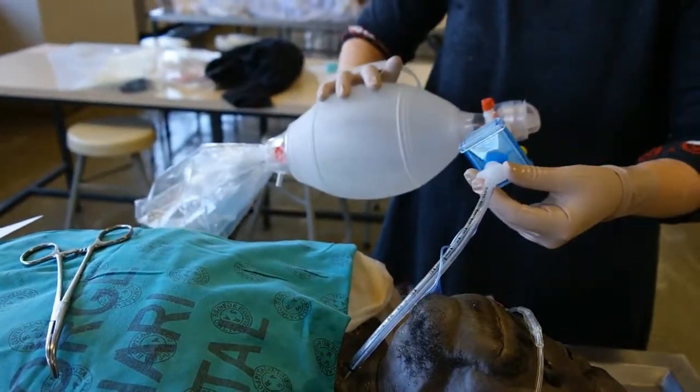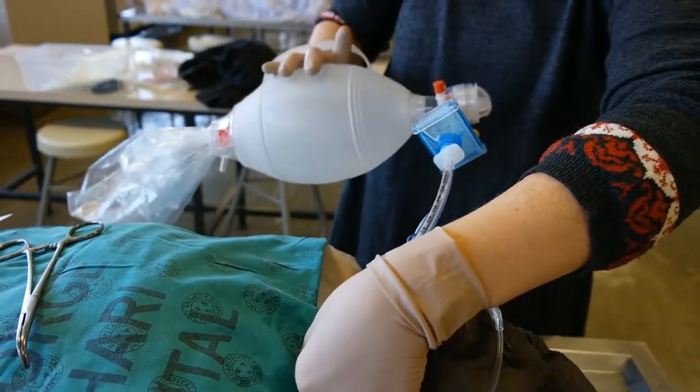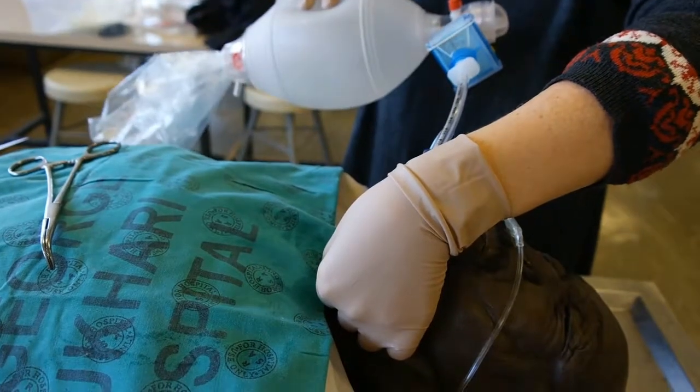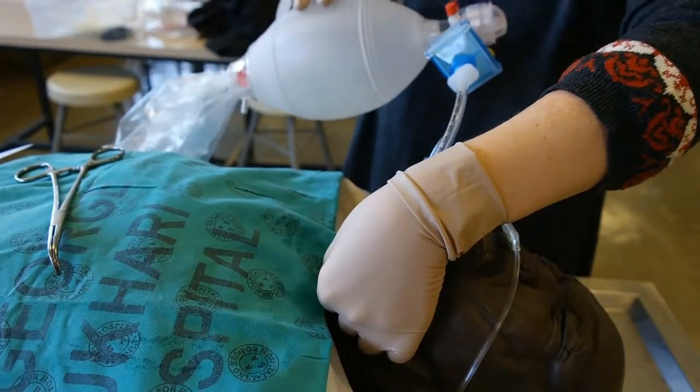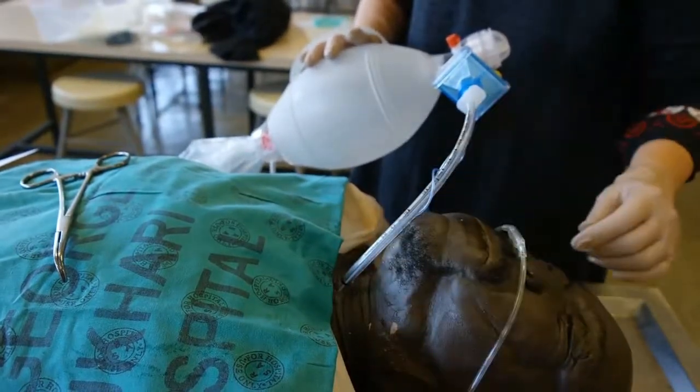Attach your ambu bag. Hold the tube at the incision site and ventilate the patient, performing 5-point auscultation to confirm placement. Tape can now be used to secure the tube.